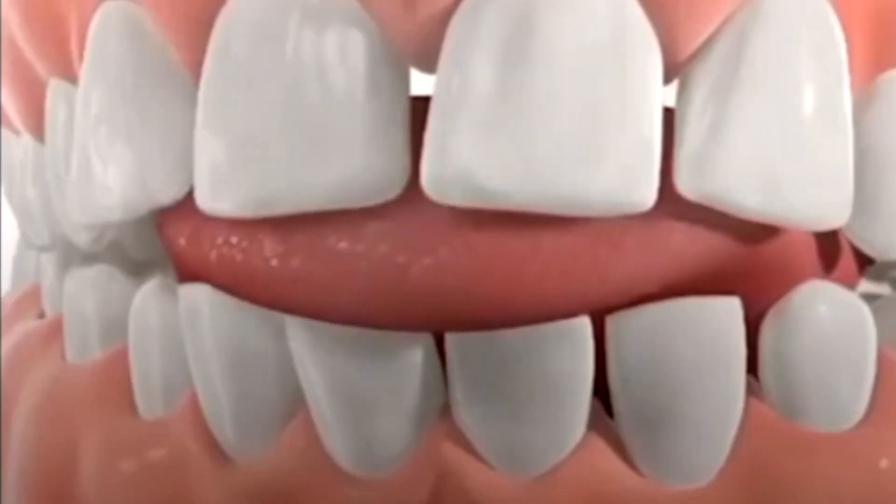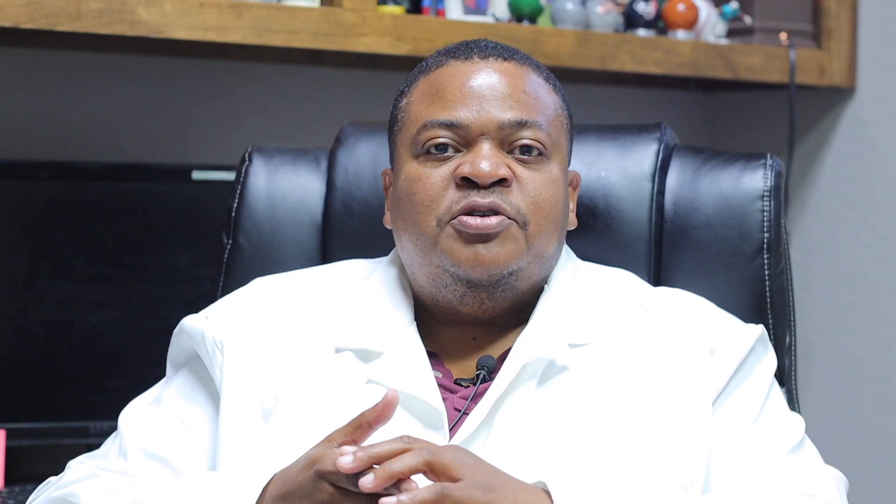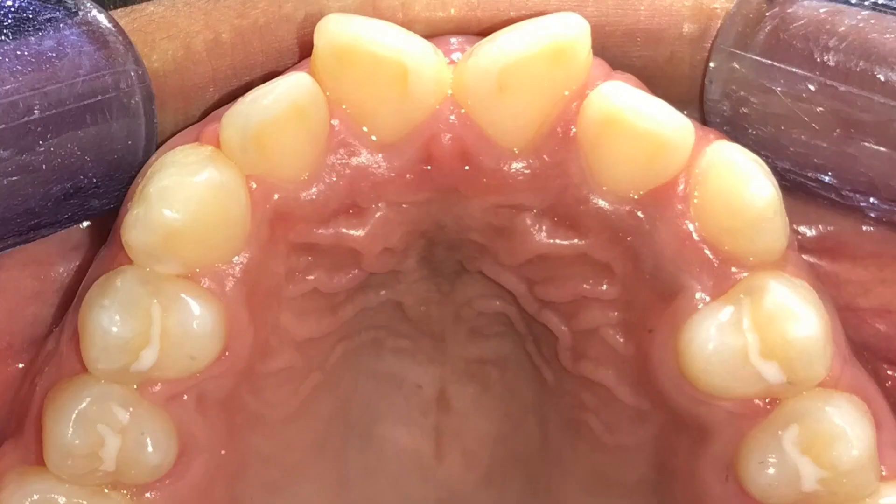In this case, we had a young guy who had a tendency to put his tongue in between his teeth. Keep in mind, you swallow hundreds of times per day and your tongue is a very strong muscle. If you continually put your tongue in between your teeth — what we call a tongue thrust — it's not a good swallow. We really need to retrain you and teach you how to swallow correctly. His bite was open, partly because of the tongue thrust.